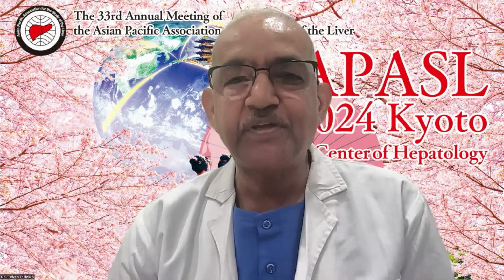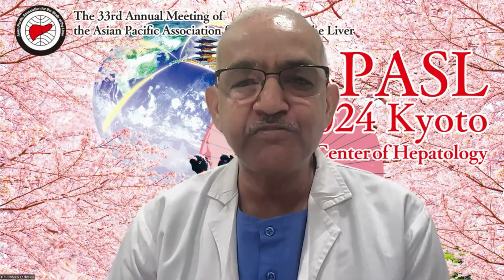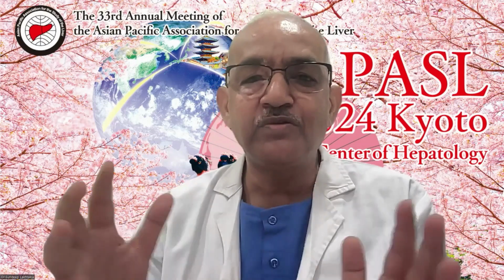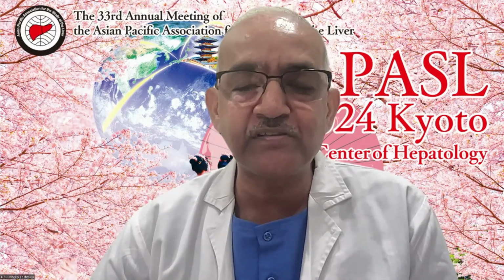Thank you for that question and comment. Whenever we do this EUS-guided intervention, first we fill the fundus, especially for gastric varices in the fundus, with some water, 100 or 150 cc, to distend the lumen, and then the varices are seen better. And if you spend some time carefully, you will see some feeders.